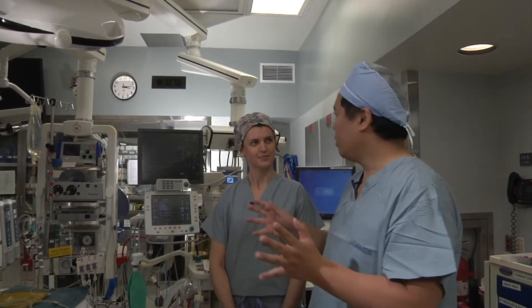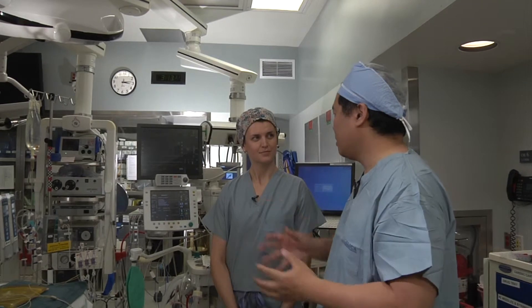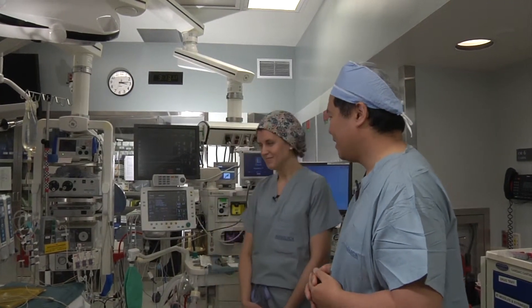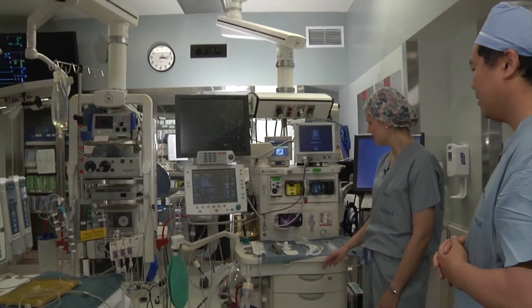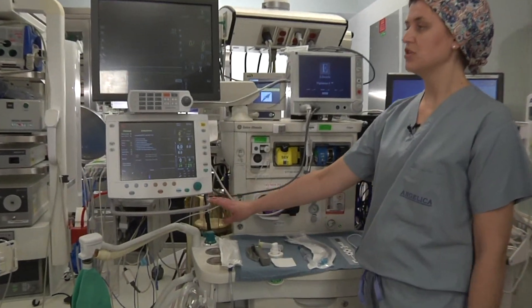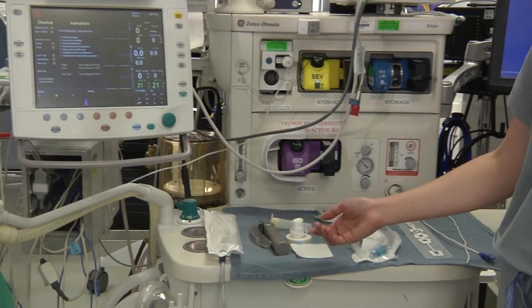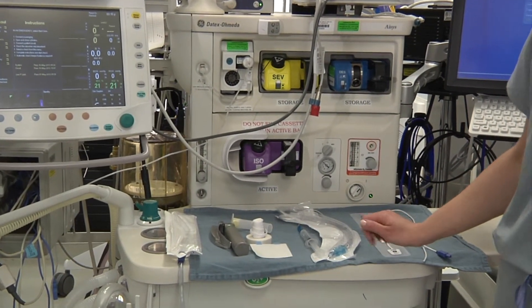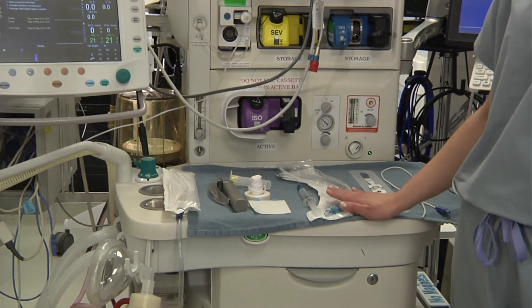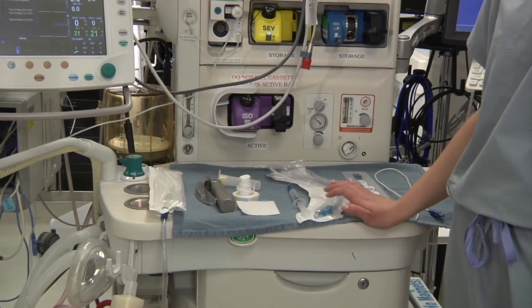I'd really love for you to show me, in the same order that you did your talk earlier, where things are located in the room. So, as in the presentation, we're going to start at the anesthesia workstation, making sure that the anesthesia machine is properly checked out for the day, that we have all of the airway equipment nicely laid out, and ensuring that we have a large 8.0 or 8.5 endotracheal tube.